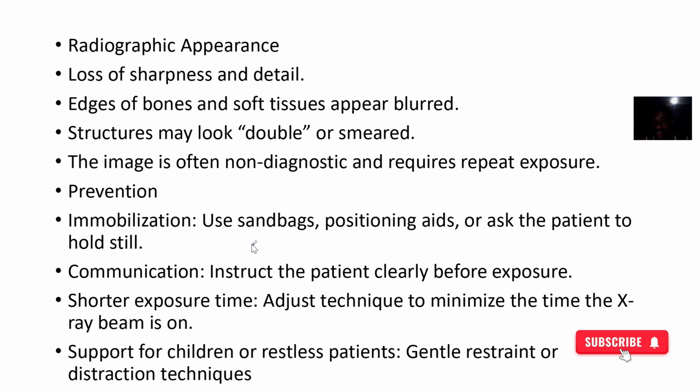To improve this immobilization, you can use sandbags or positioning aids to help you. Communication: you have to be open to the patient. Hey, please don't move. And you have to be accurate in everything you do so that the patient is not bored by being there for too long.